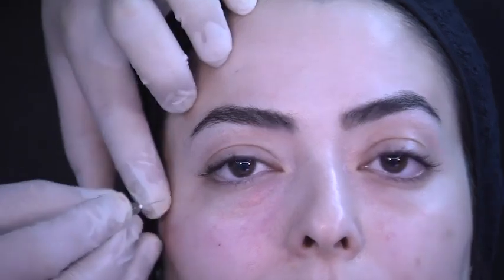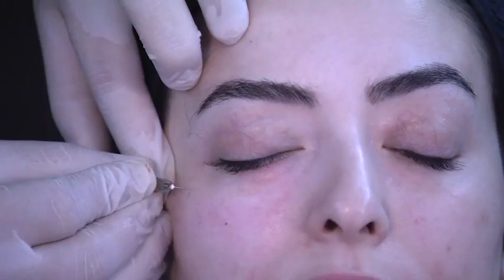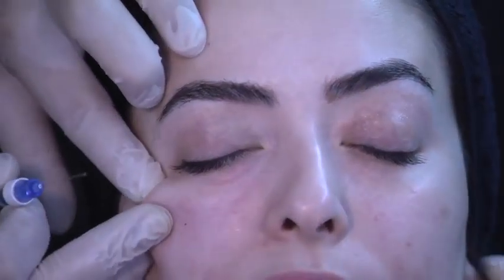Okay, so entry point, same technique. We're going to go under the muscle. Sometimes we need, can we go down with the chair a little bit? So you're going as well under the muscle in that part, right? Yes, so we will have the retaining ligament here. It's a little bit tough sometimes to go through it. You will palpate the resistance. But you have the muscle. Sorry? Tear trough has to be under the muscle, always.